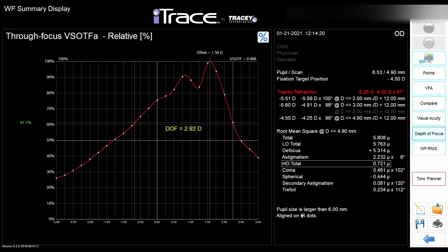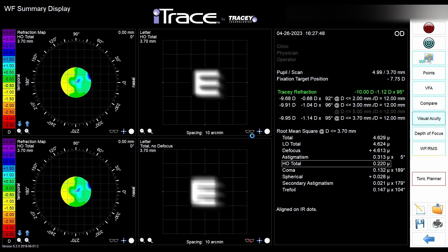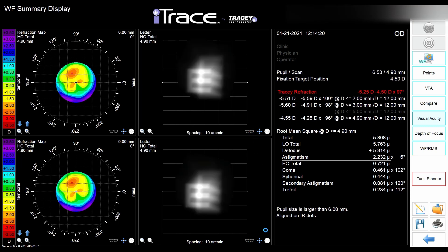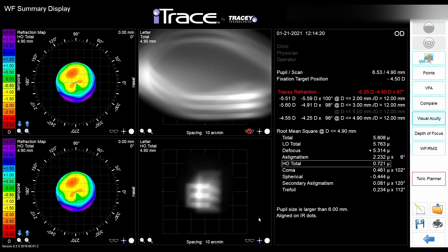Everything below the green line is out of focus. For instance, if you're considering monovision for a patient — if both eyes already have some sort of monovision because one has a different focus than the other — the patient is certainly a good candidate for that type of correction. All displays can be seen with glasses, without glasses, and without astigmatism, which is very useful for explaining to the patient how their vision is right now and how it can actually be improved.